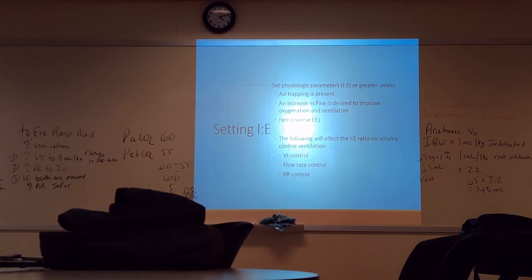Now, if you watch the vent, and you've seen me play with it where I was breathing for it, and when you get to rotation, this will make more sense. But you can have somebody who's breathing 25 in a 3-minute time frame, and then goes down to 10, and then to 20, and then to 15.